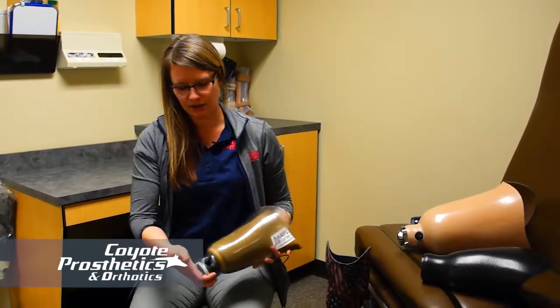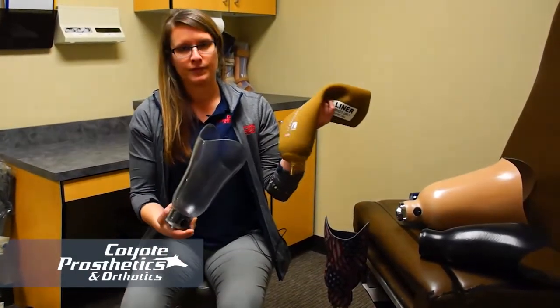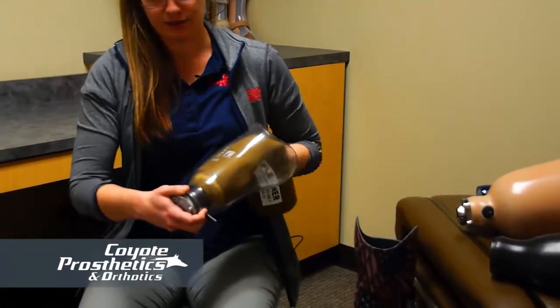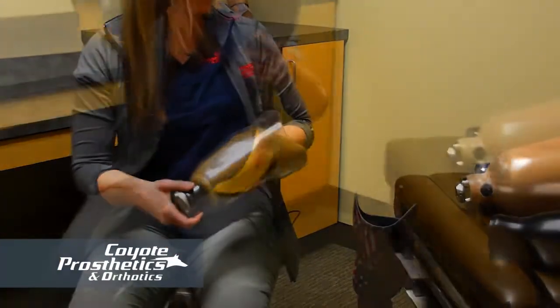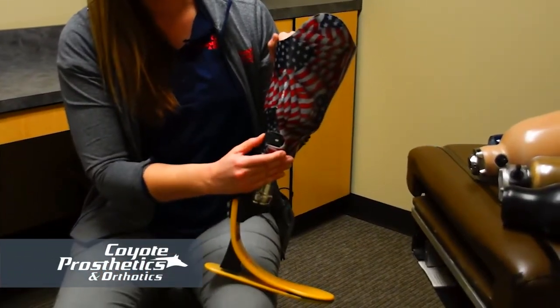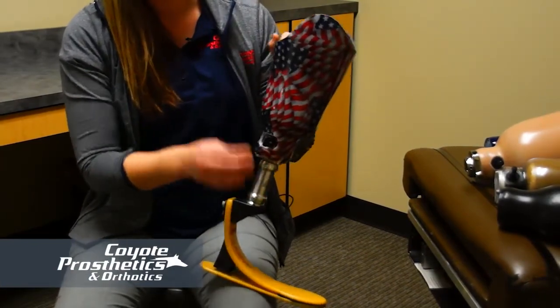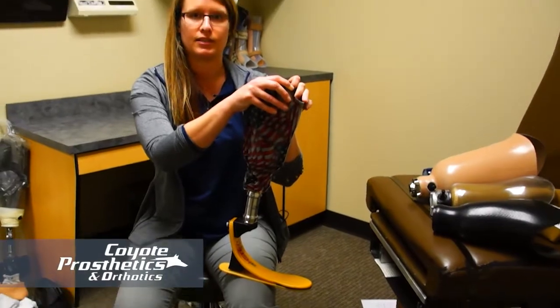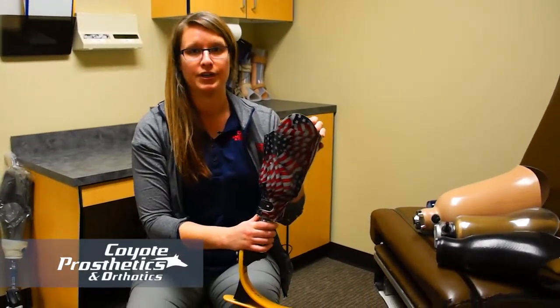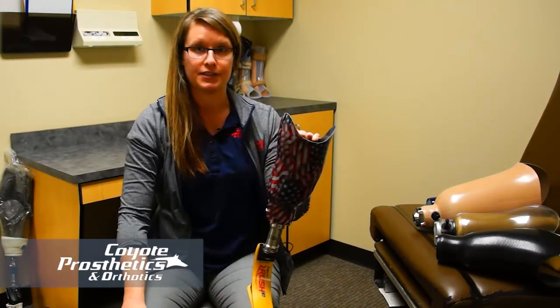This is the air lock, which is just a push button release. That's how you get the pin out, and then you don't have to push anything, it'll just click in. And this is the easy off lock. With this one, you can just click the pin in, and then to release it, you open it, and you can use both hands to take the prosthetic off. However, you want to make sure that you close the lock when you're done so that it's ready to go next time and the pin is ready to engage.